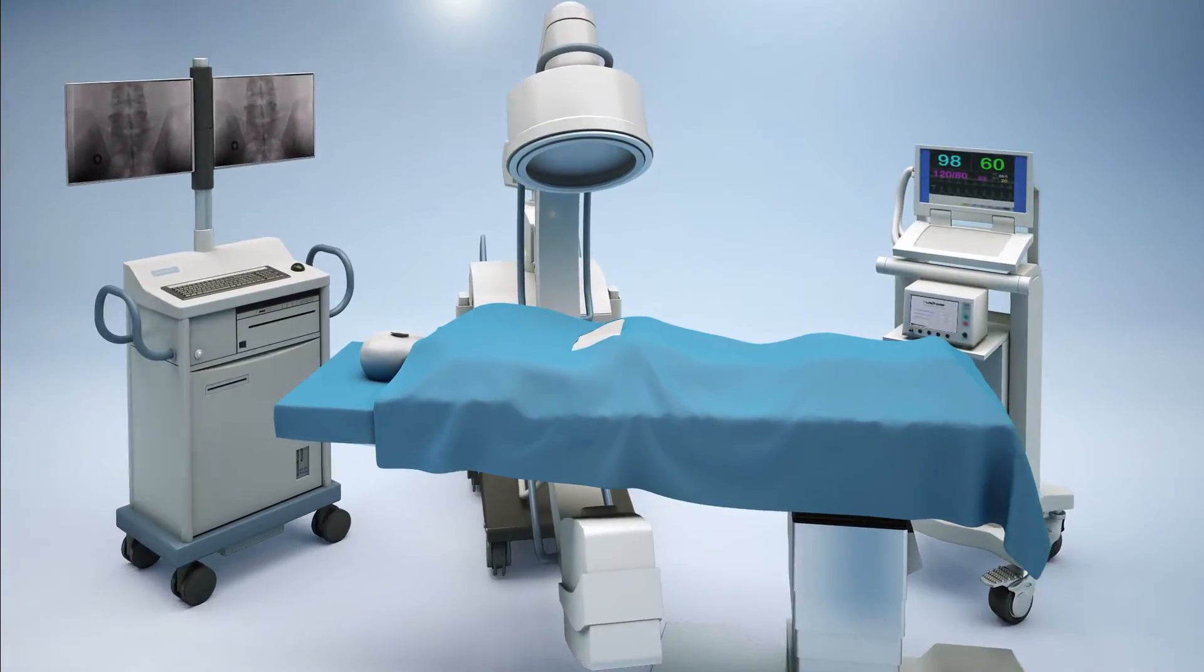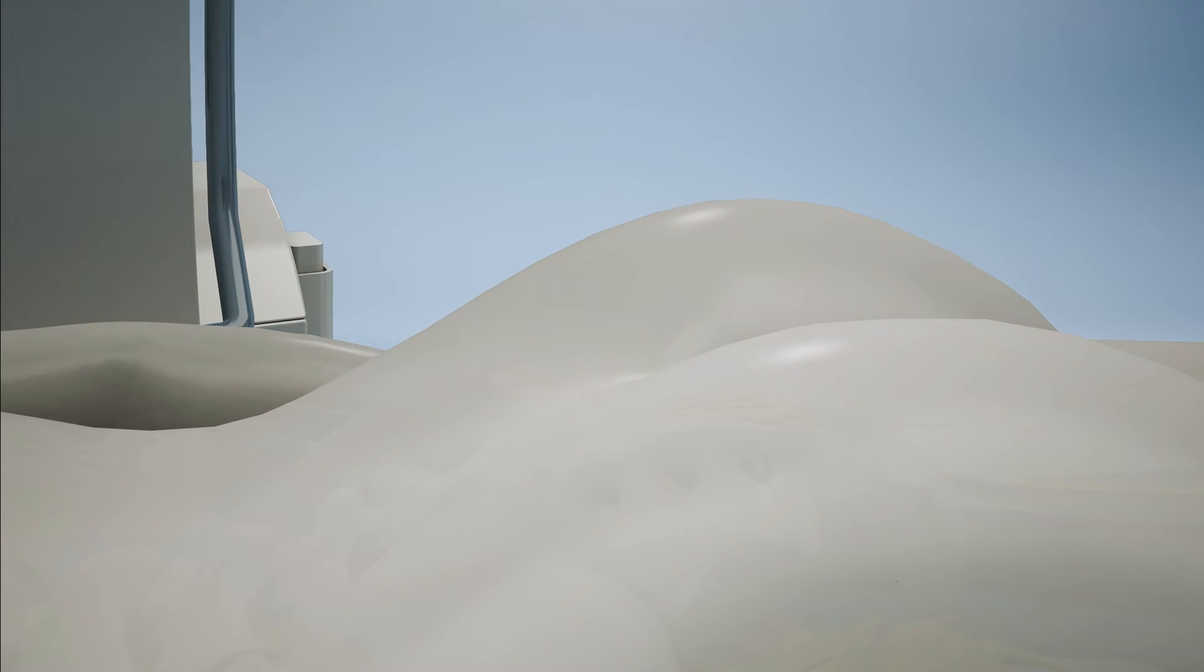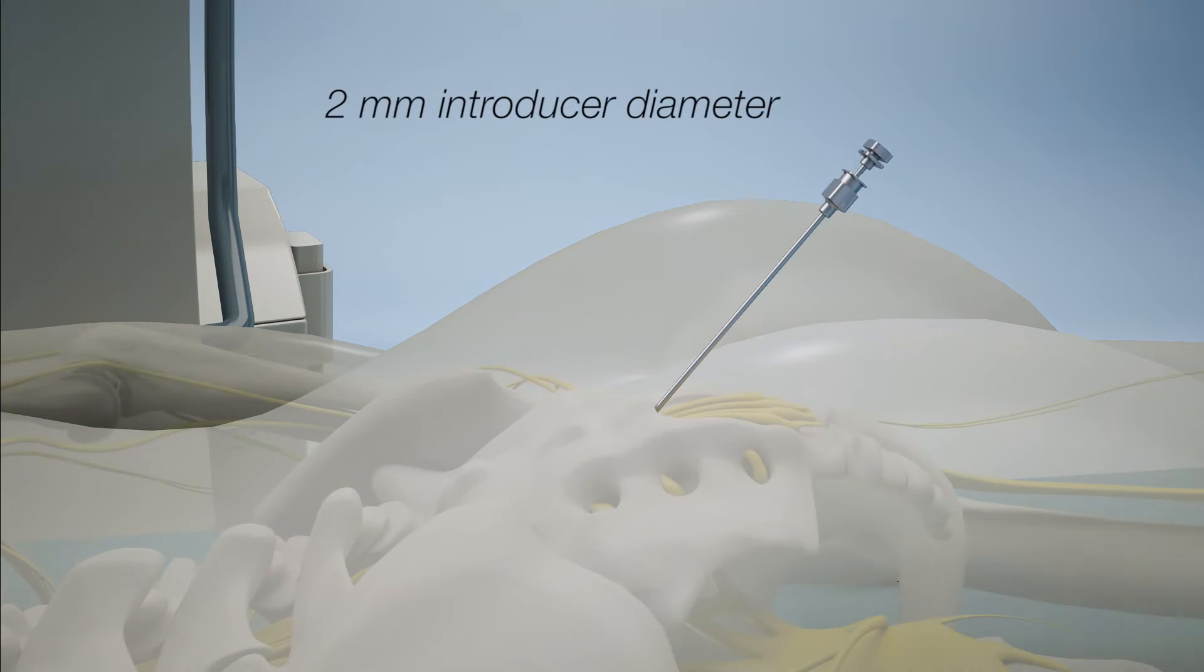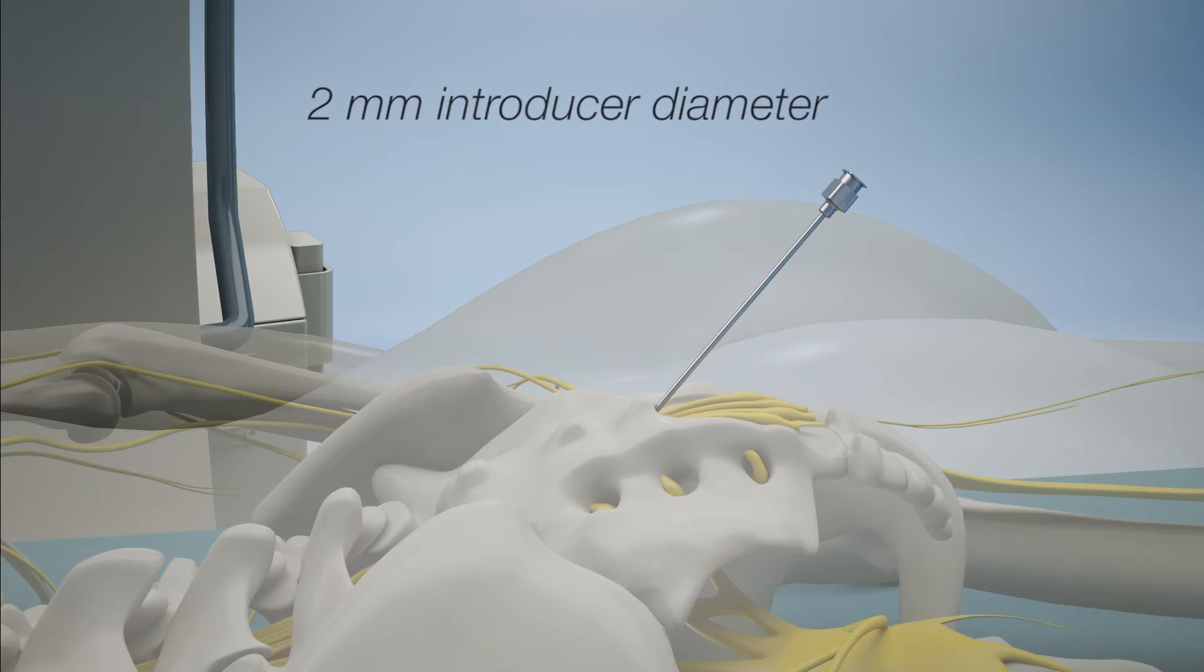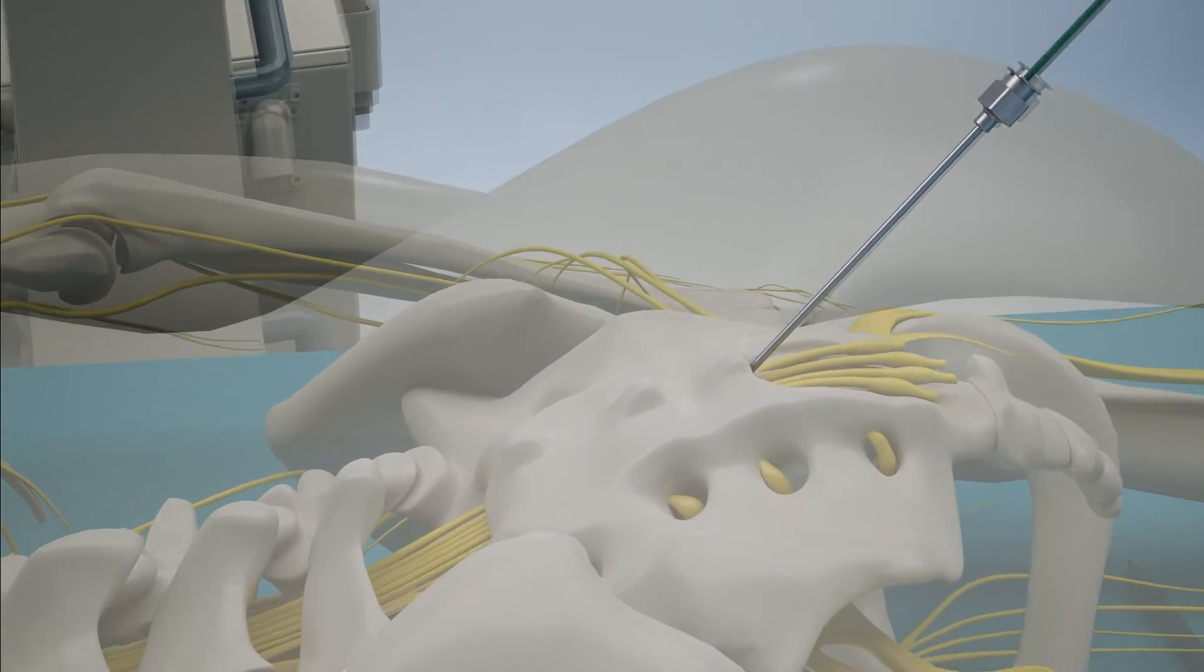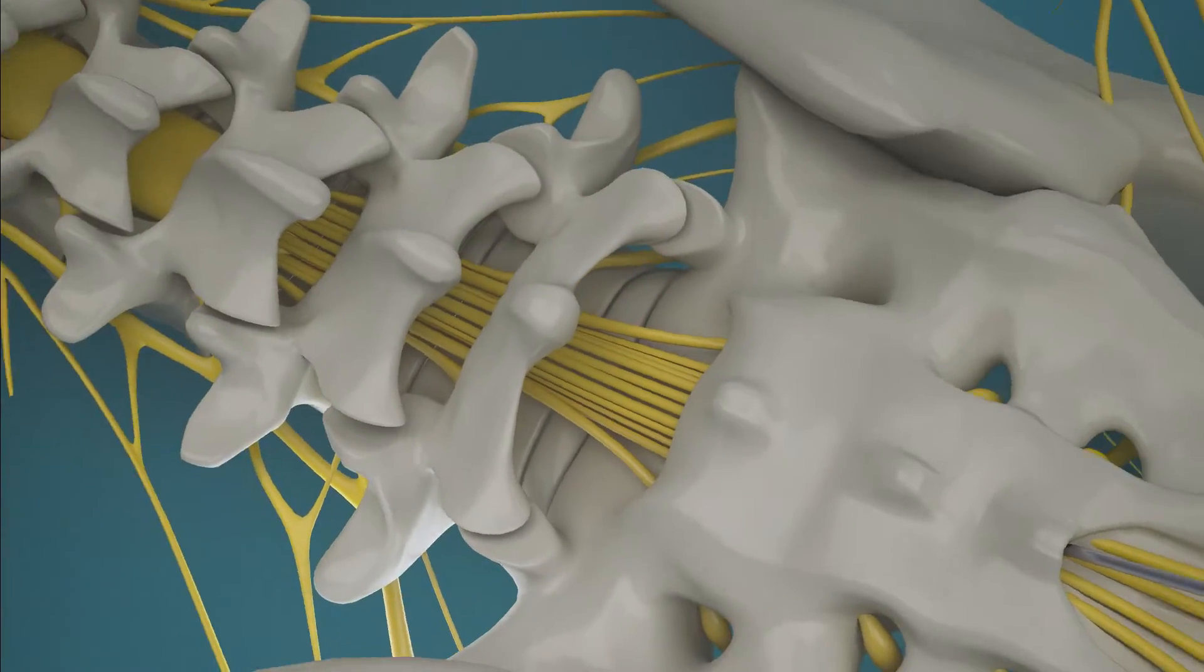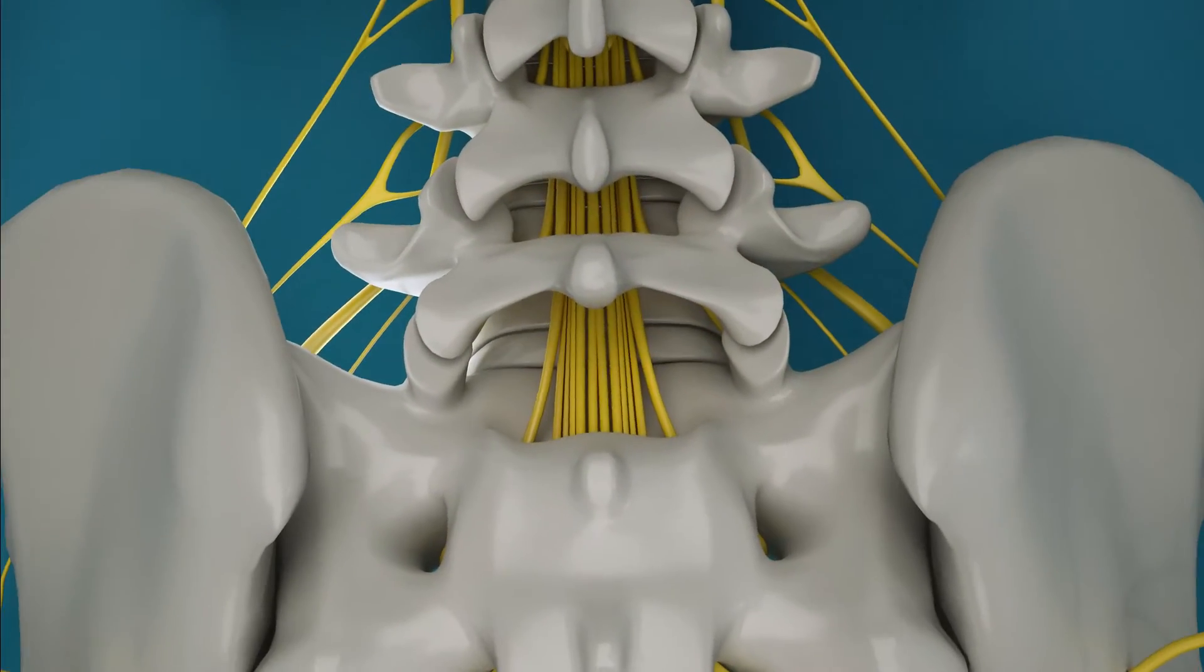The patient undergoing the procedure is laid on a bed in the prone position. A local anesthesia is effected in the coccygeal or paravertebral area, where the access introducer will then be inserted. The entire procedure will be conducted through this introducer needle, which is only 2 mm in diameter, and the patient will be awake or at most, mildly sedated.